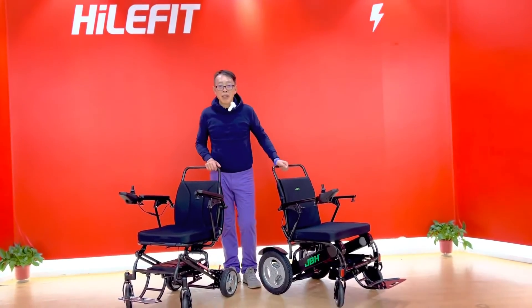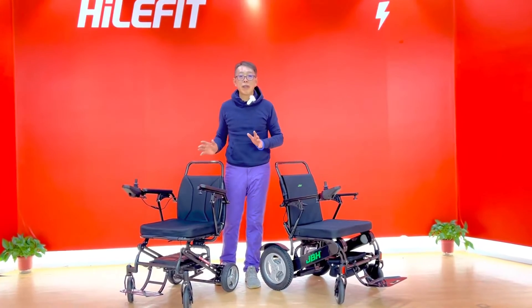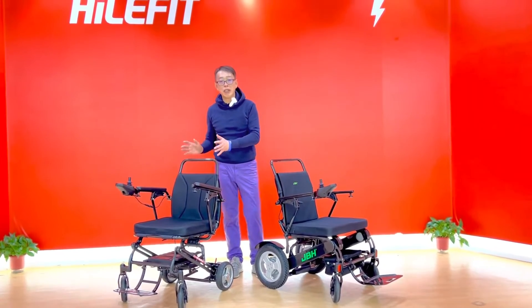Hello, my name is Kevin from JBH. Today I'm going to compare two different models of carbon fiber wheelchairs. This one is DC03, and this one is DC05.